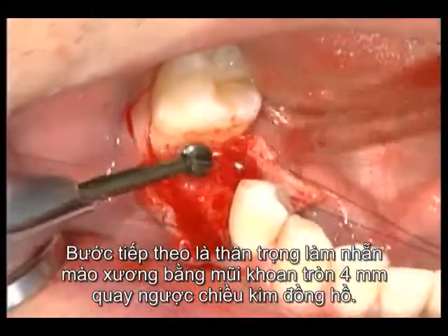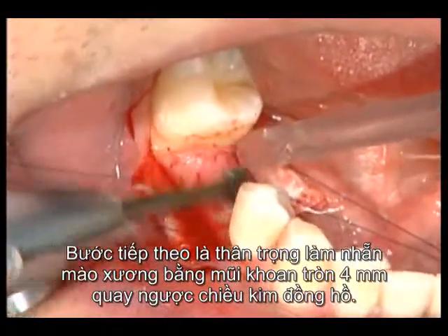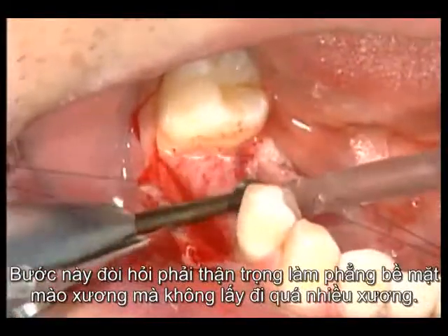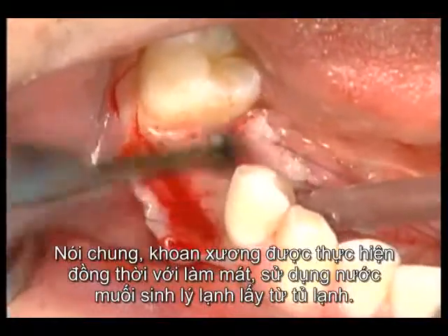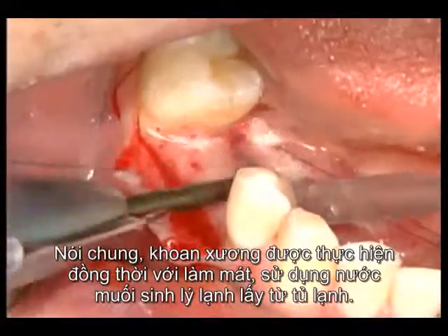The next step is to carefully smooth the crest with a 4mm round burr in counterclockwise rotation. This step carefully flattens the crest surface without taking off too much bone. In general, bone preparation is done with ample cooling, using a chilled saline solution from the refrigerator.